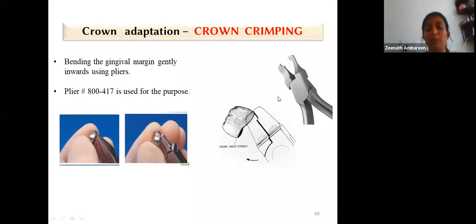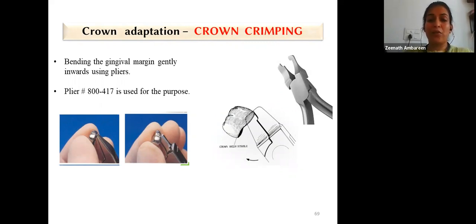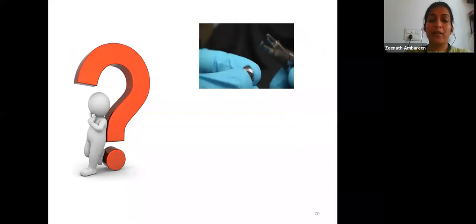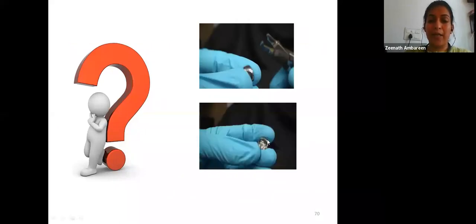After contouring, crown crimping is performed using crimping pliers. The gingival margin is bent gently inwards, which enhances mechanical retention of the crown, prevents exposure of cement to oral fluids, and maintains gingival health. Contouring is done in the middle third of the crown, whereas crimping is done on the cervical third of the crown.